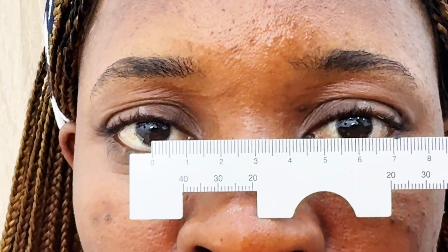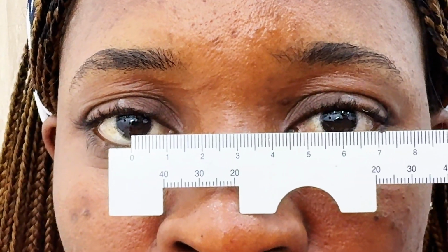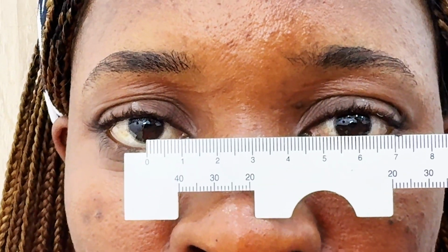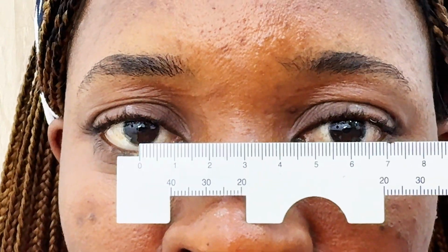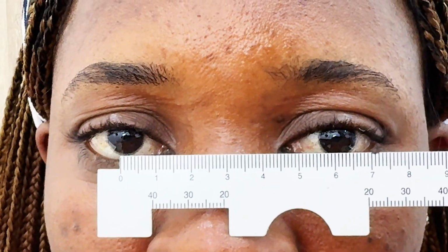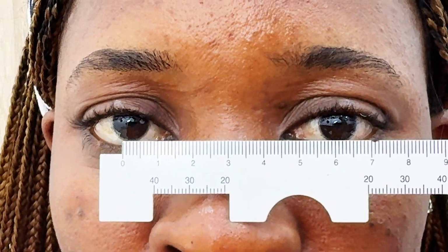I line up the zero mark at the center of her pupil, and then I close my left eye and I direct my patient to look at my right eye. And then I measure it at the point where the rule bisects her left pupil.